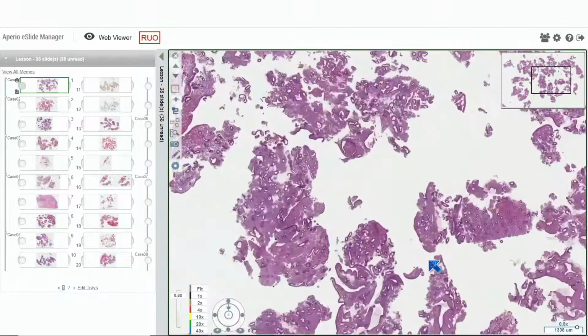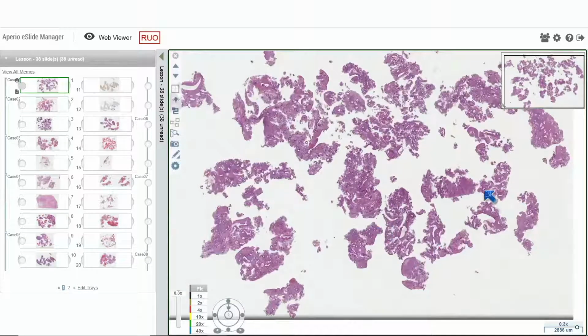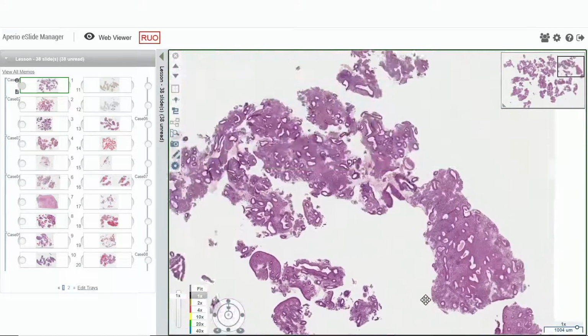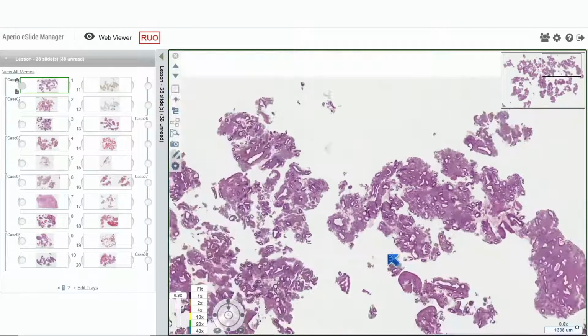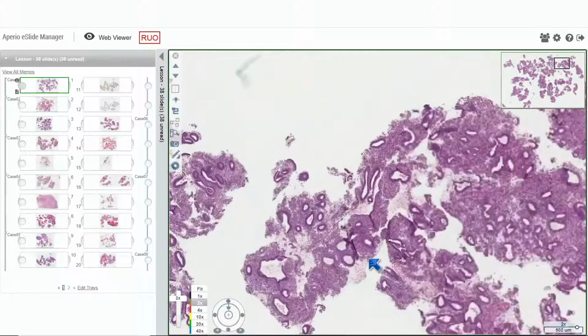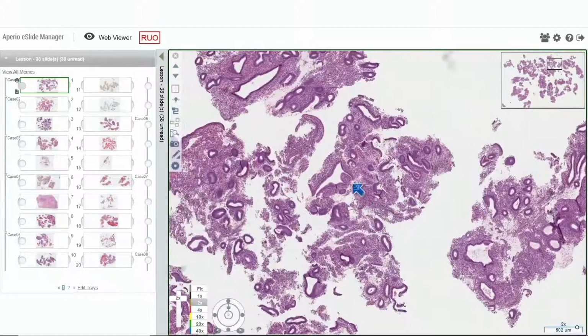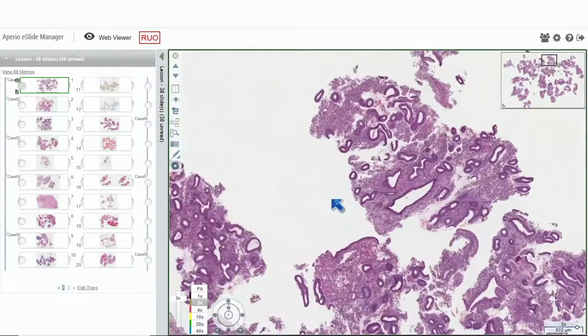And I think this is rather an easy case. You can see that it's multiple fragments of tissue that if you go down and wander around, it doesn't really look like there are extra glands or an increased number of glands. But what you do notice is that there's starting to be cysts, right, throughout this endometrium.